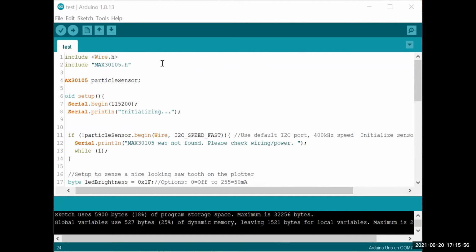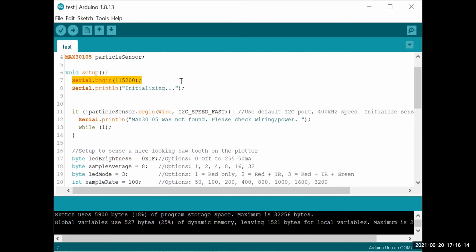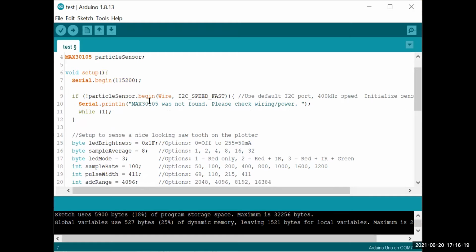So you're going to need two libraries, and I'm going to teach you all how to do that during class. Let me scroll to the left a little bit. Then we're defining the actual type of particle sensor that you have. And then we're starting the serial monitor. This line's not actually needed. I'm going to go ahead and delete that for your all's code now.